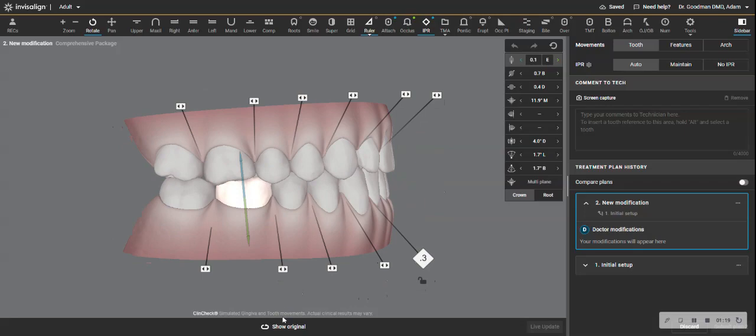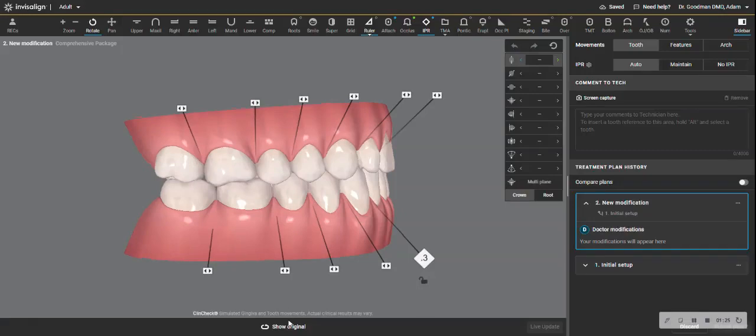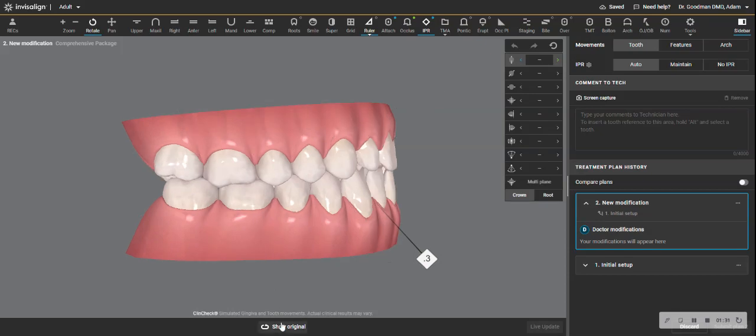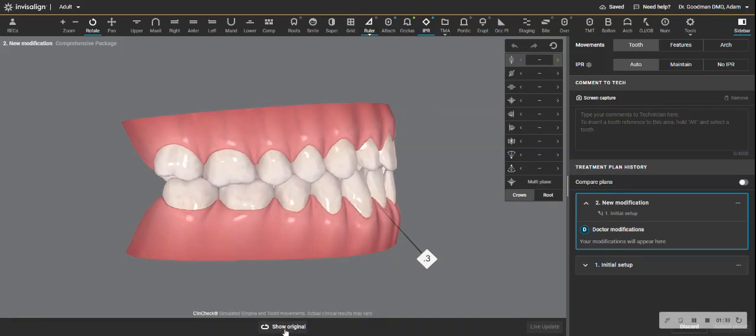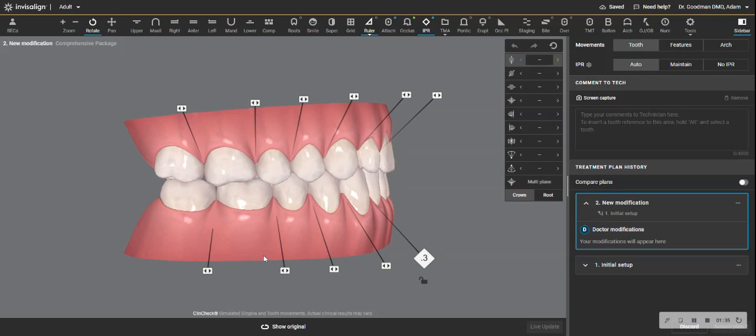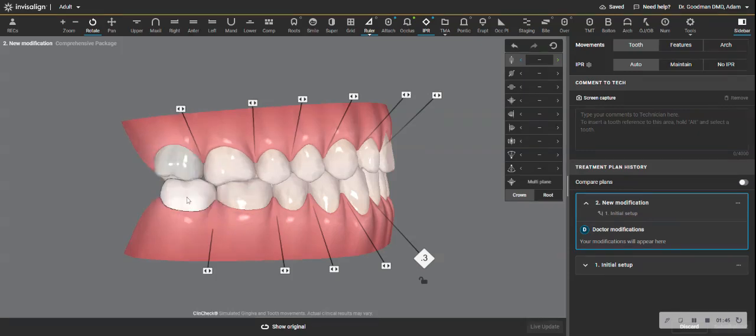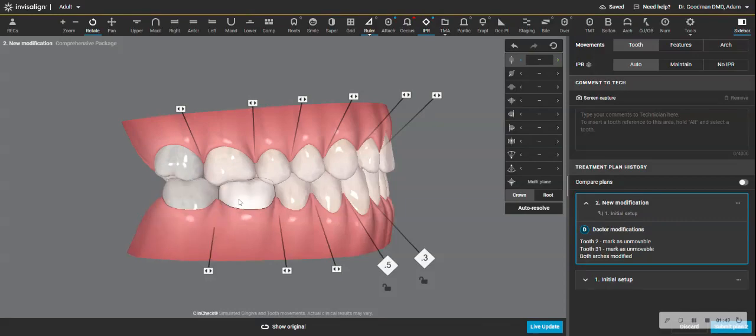This ClinCheck has minor movement. This is not necessary. It only is asking more of the aligner. And usually, these kind of little innocent movements on molars can end up not playing out and leading to posterior open bites. Because if the movement doesn't play out on a stubborn tooth, a multi-rooted tooth, that force can be driven in an intrusive fashion. So I right-click, make unmovable on all the molars.